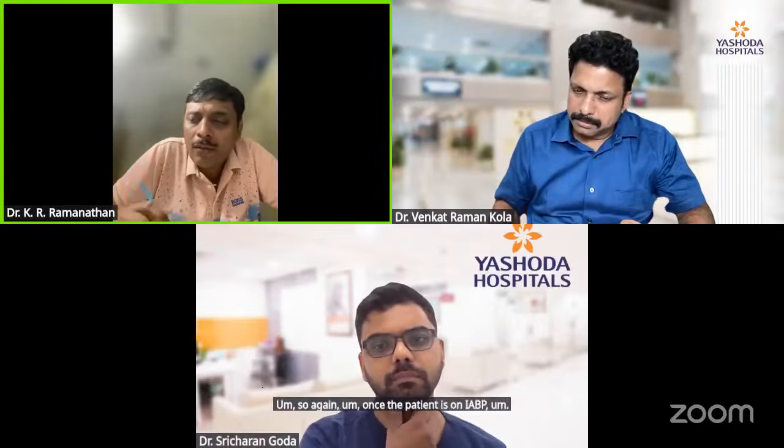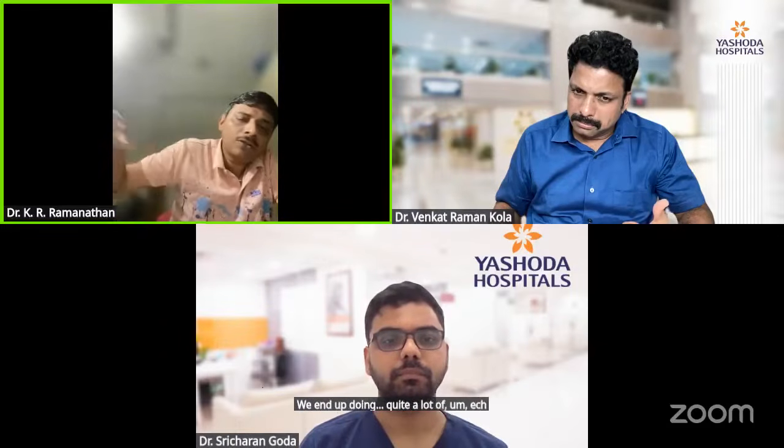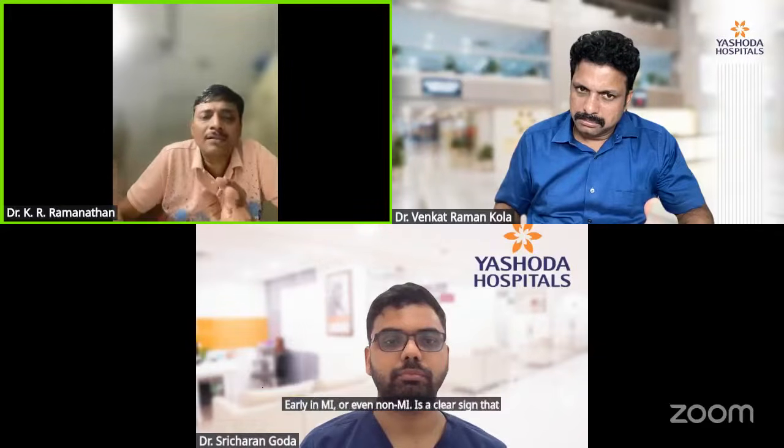Once the patient is on IABP and on ECMO, we end up doing quite a lot of echoes during the course. A few things that get assessed are the LV dimensions, the aortic valve openings, and the aortic VTI. A drop in aortic VTI, early in MI or even non-MI, is a clear sign that the LV is tiring out.